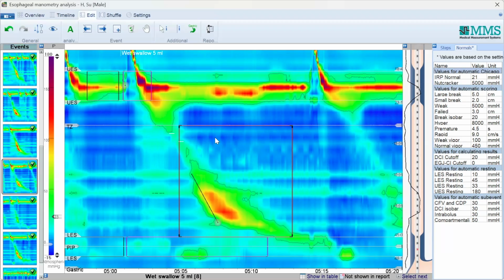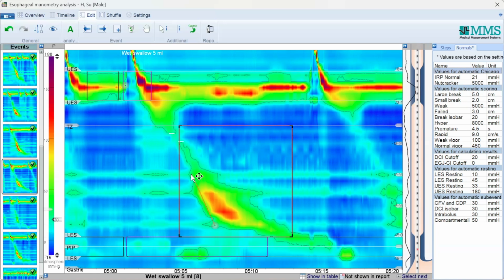If you deem that the patient has achalasia but they don't, and they end up doing something that they don't need, it is definitely not something that we want to offer to our patients unless it's correct. So yes, it's very important to pay attention to the whole procedure. And the whole procedure shouldn't take too long if you know what you're doing, if you're doing it the right way.